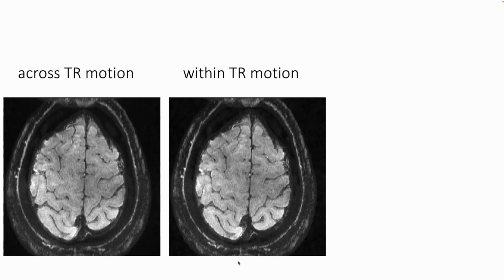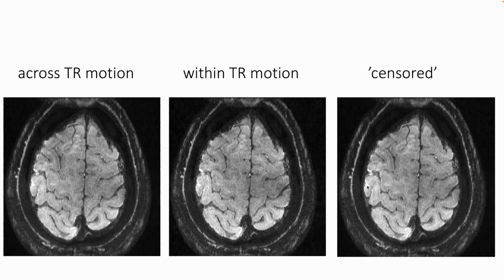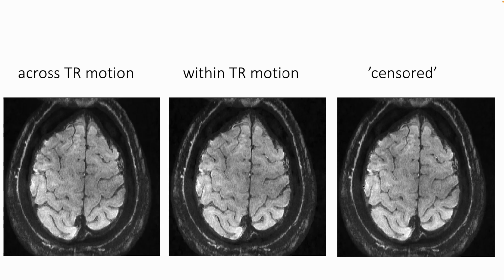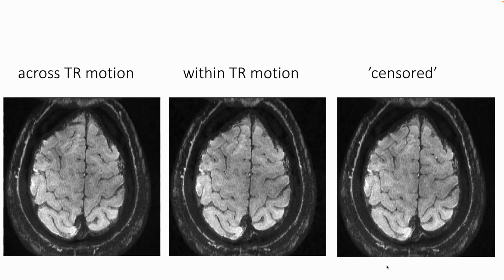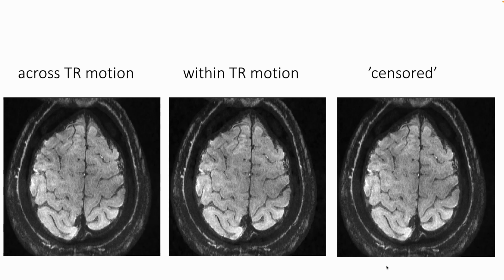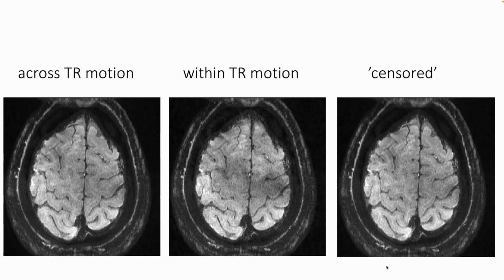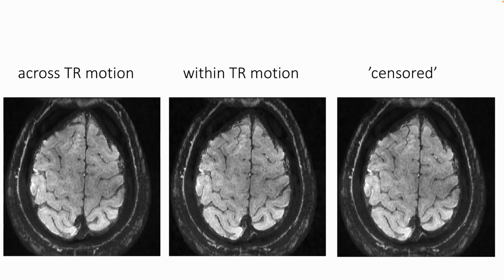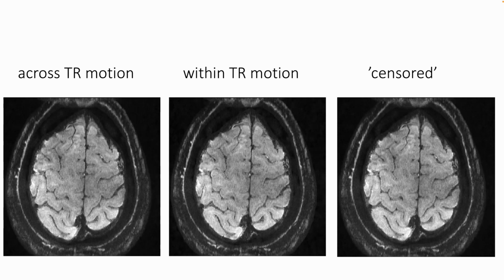There's still a bit of residual fluctuation going on here, as you can see, which comes from within-TR motion, especially in the segmented multi-shot 3D EPI methods like this one over here. This is a form of spin history effects in EPI or coming from EPI phase errors, like these flickerings across the TRs, which can, again, still be censored in the analysis later. So you're taking those data out of your time series and then end up with very clean time series, as you can see them right over there. So in fMRI, as long as people don't move constantly, all the time, the motion-related dropout rates, or data sets that are not usable due to motion, are not really something that limits us from pursuing a certain study.